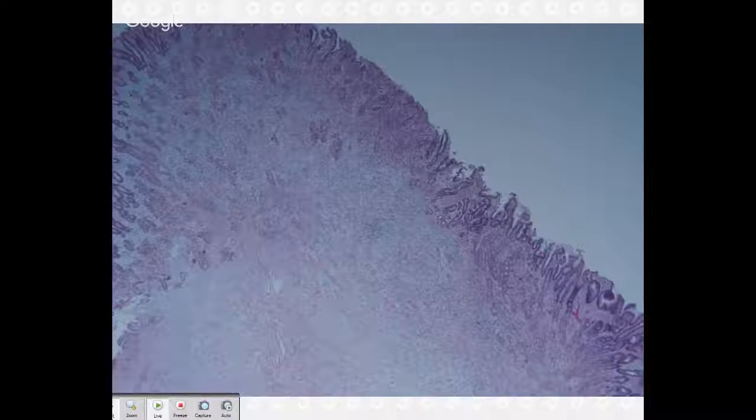All right. So I've already picked on the nice doctor to my right, so it's somebody else's turn. I'll either point or someone can just tell me what you're seeing on here. We have a submucosal spindle cell lesion with vascular proliferation.